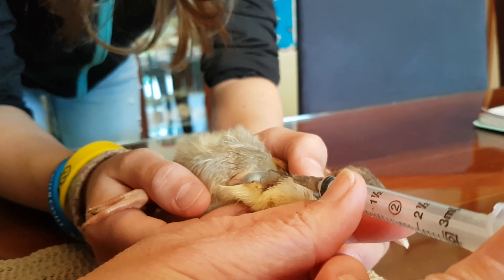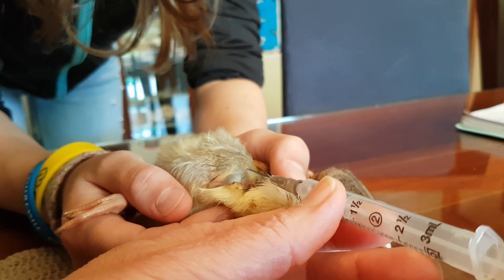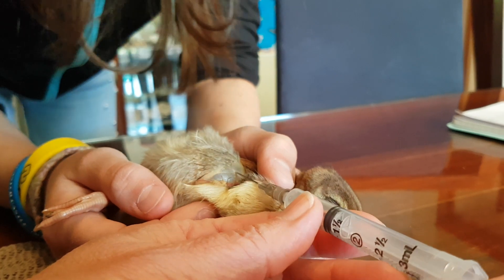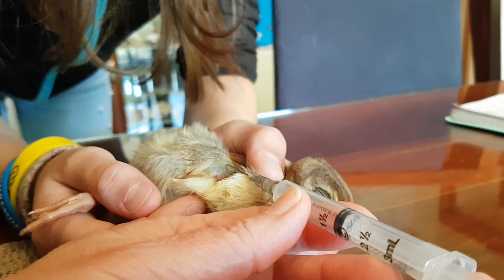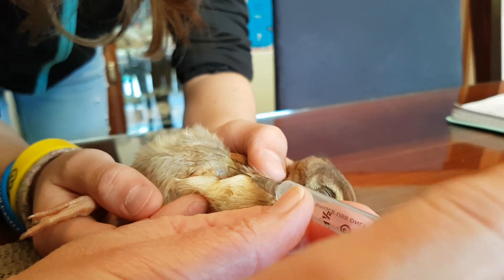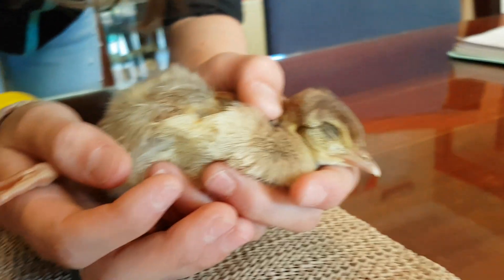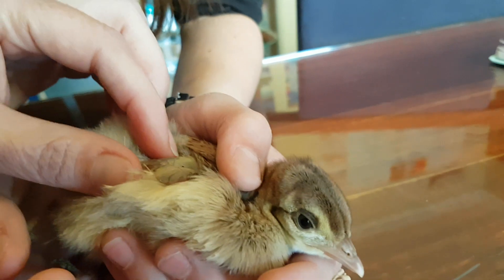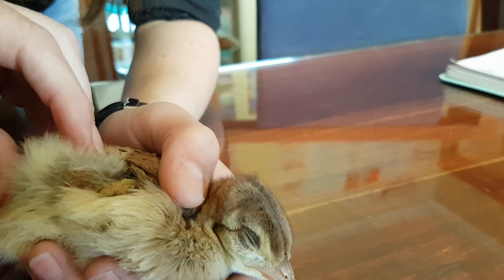There we go — easy in. Let's just draw that air out. Going nice and slow for this. You can actually see the needle inside there still — through the skin. Look, it's going down. That'll be giving her a bit of relief. So what she's done is ruptured one of her air sacs inside along her right side, and the air has already come out of that. There we go — look at that, all going down.